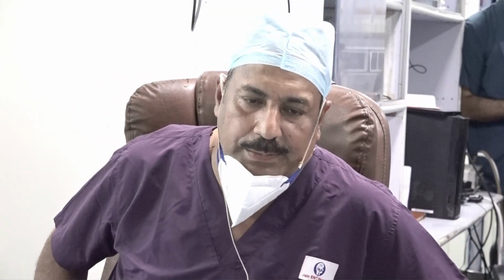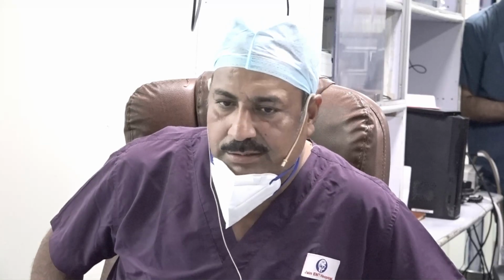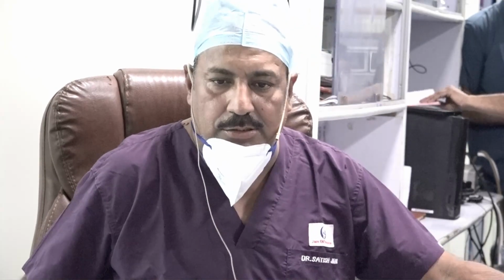I'll request everybody to come out with your suggestions, questions, whatever, to make it more and more interactive. And the next case, cochlear implant, will be after this tympanoplasty case. So anything else you want me to? Sir, for the beginners, any key point regarding pediatric tympanoplasties?